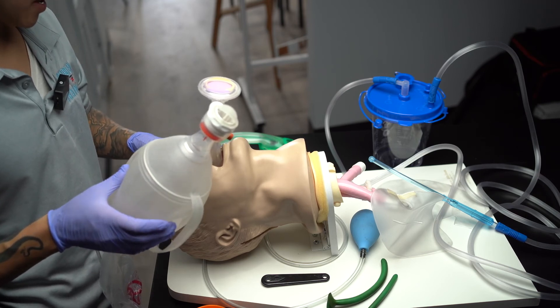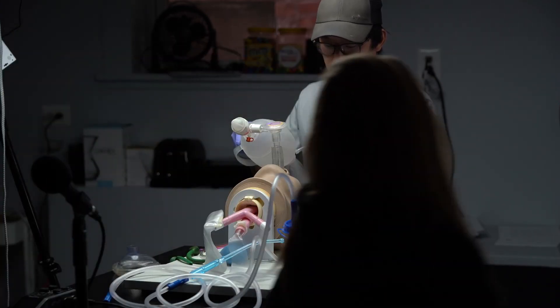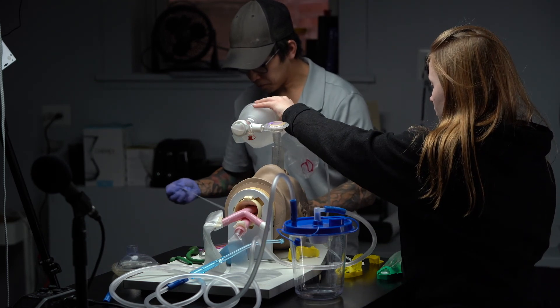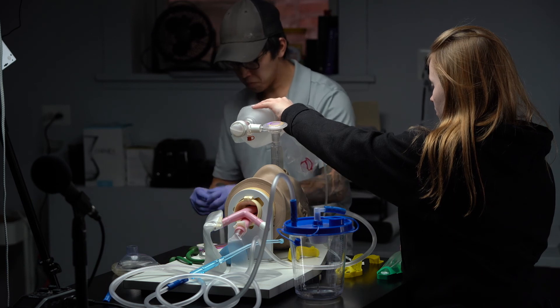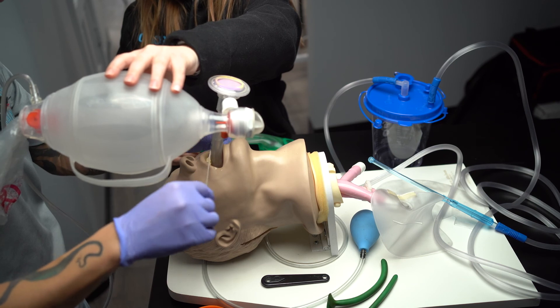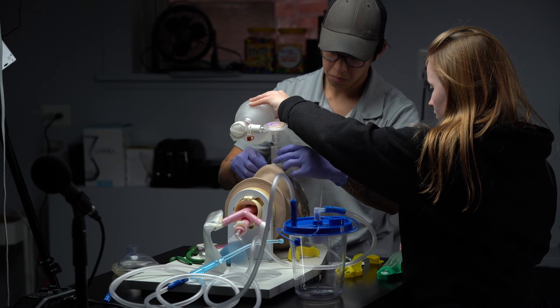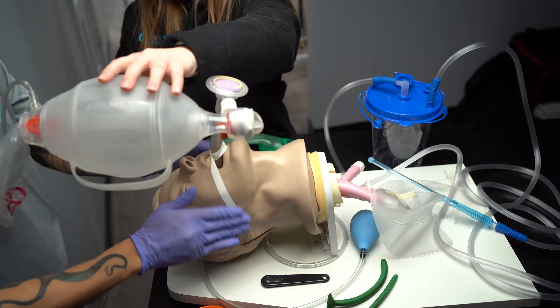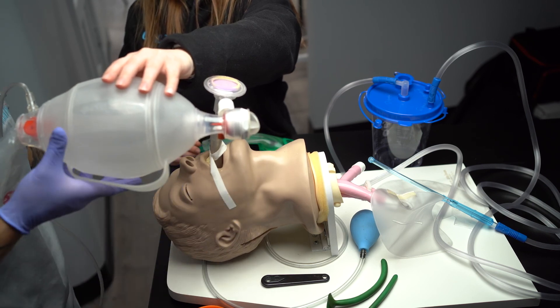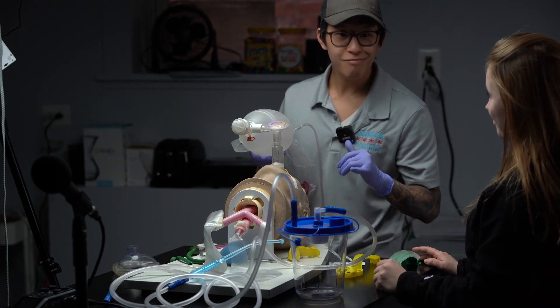At this point, can you assist me and continue to ventilate while I secure the i-gel in place? Just ventilate once every five to six seconds. At this point I am complete with the management and will load the patient up on the stretcher and transfer to the hospital. That's it.